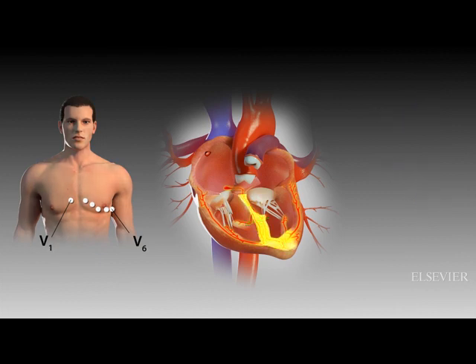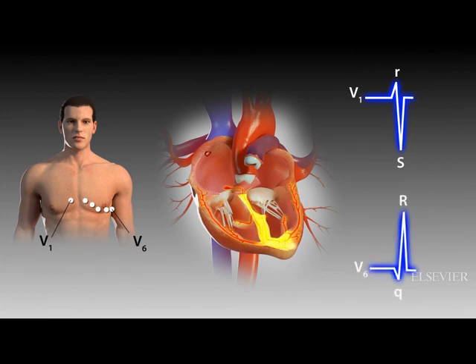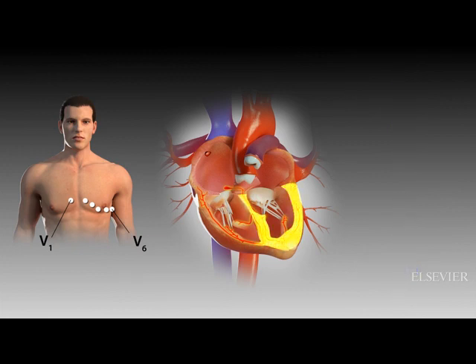The second phase of ventricular stimulation is the depolarization of the left ventricle. Right bundle branch block should not alter the second phase either, because the left ventricle, like the septum, is depolarized by the left bundle branch, producing deep S waves in the right chest leads and tall R waves in the left chest leads. The change in the QRS complex produced by right bundle branch block is a result of the delay in the total time needed for stimulation of the right ventricle.